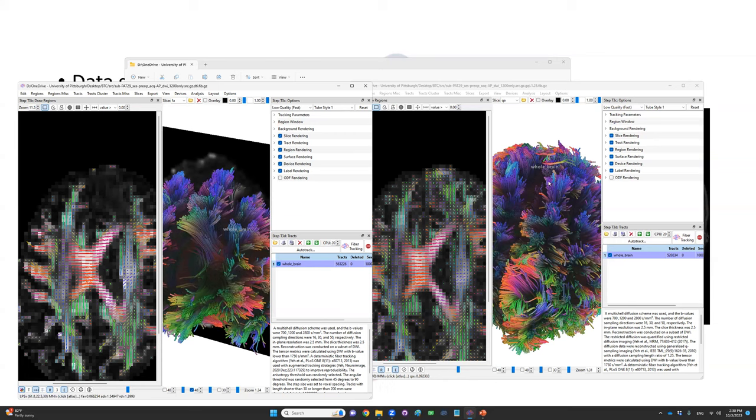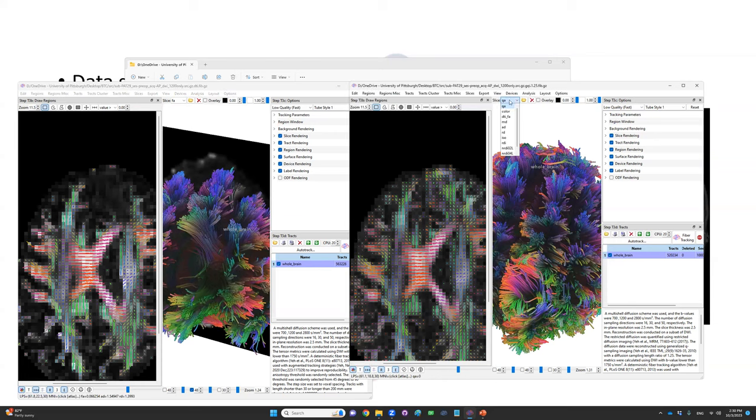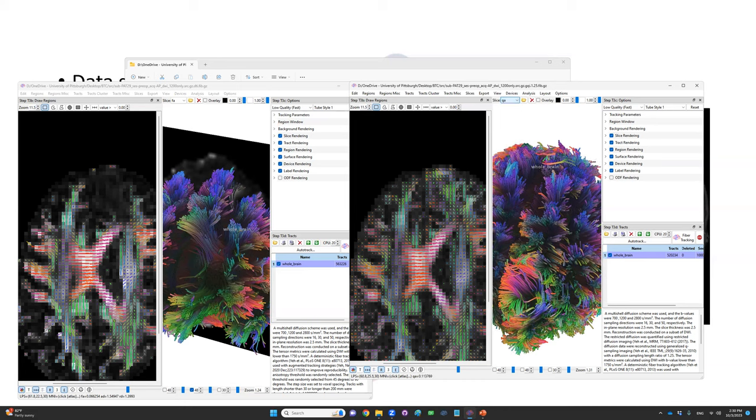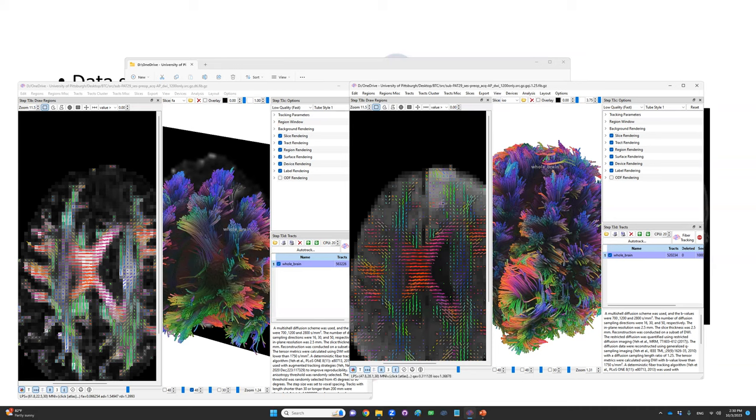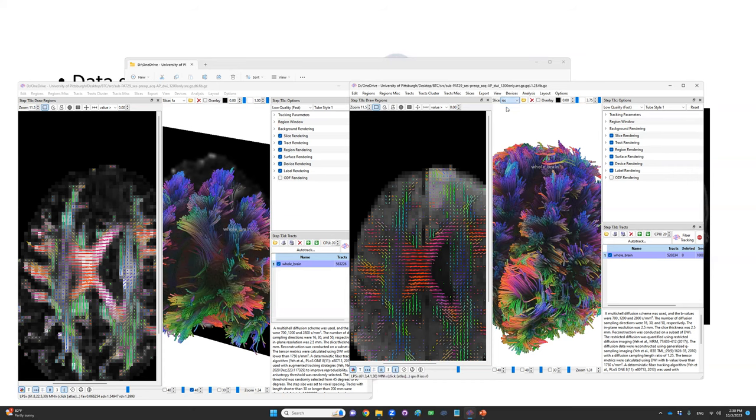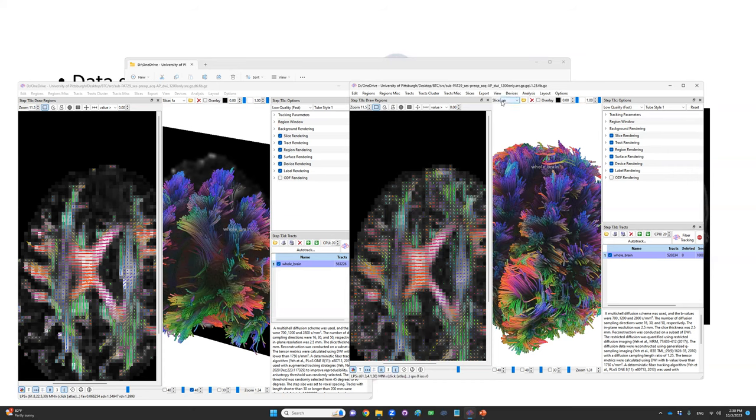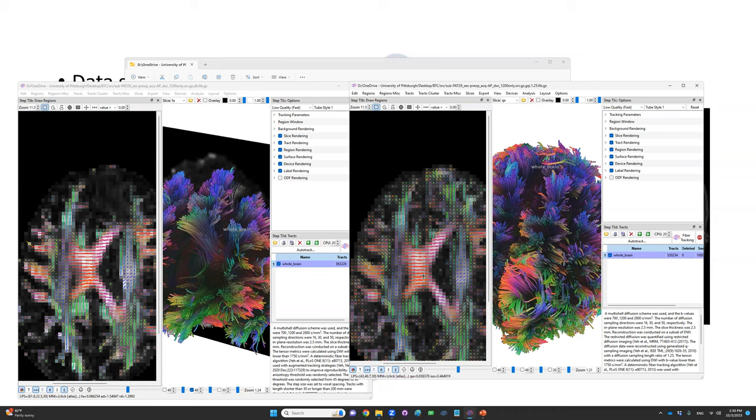In comparison, the GQI method is also able to model free water diffusion. There's an iso map here showing that some regions have a lot of peritumor edema. But the anisotropy method called quantitative anisotropy will avoid the pitfall of FA and still show there are preserved fibers you could preserve here.